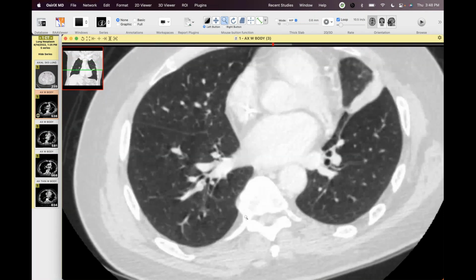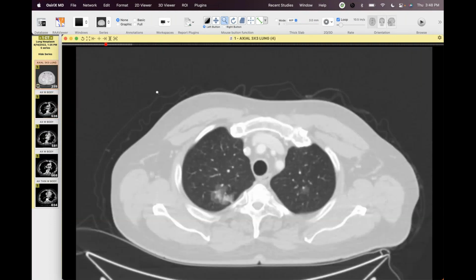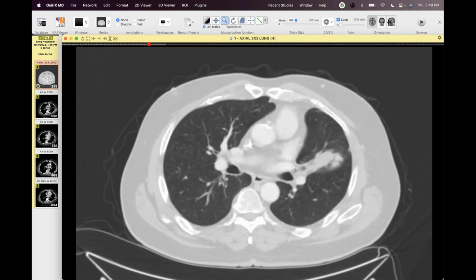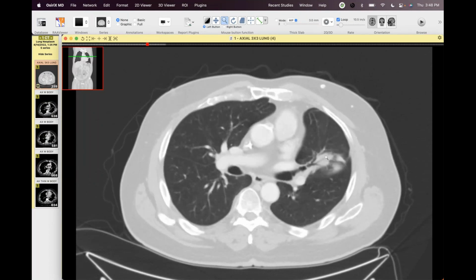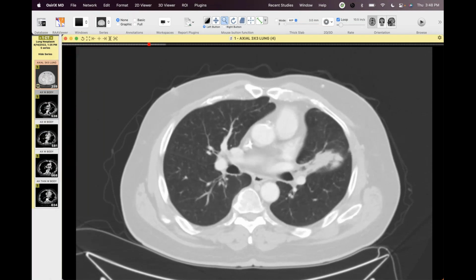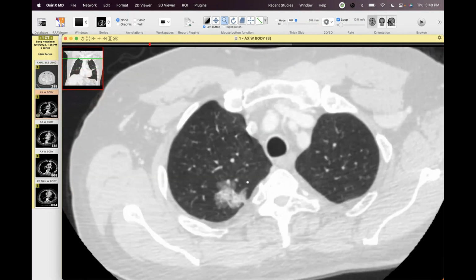Actually, this is the second CT they had. Let me show that first one, it was an outside one. Anyway, there's an older CT where they had a 7 centimeter poorly differentiated adenocarcinoma in their left upper lobe, which was actually the primary lesion they presented with. They went on immunotherapy, and that lesion responded. I thought it was interesting because this is what it looks like in 2022.